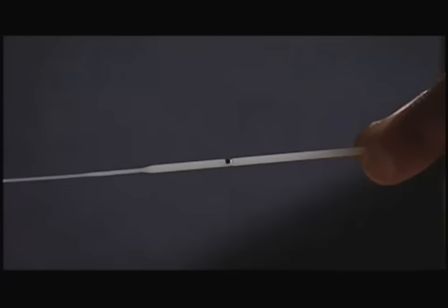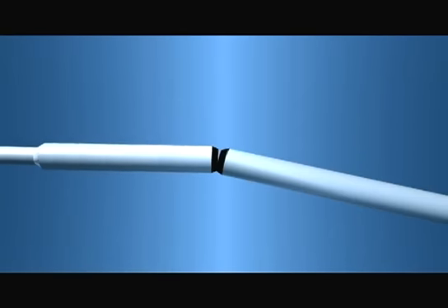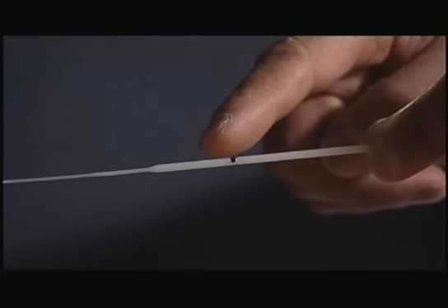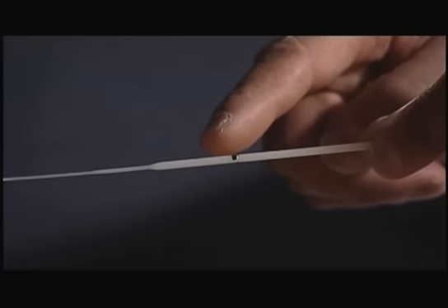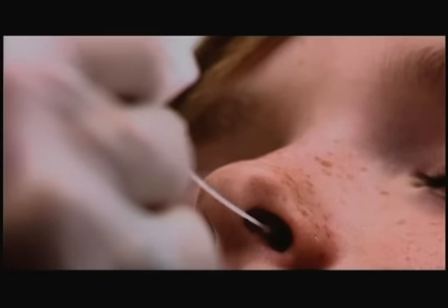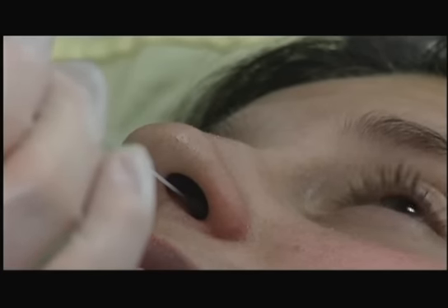On the thick part of the swab is a score line or groove shown here, which facilitates break-off of the swab into the collection tube once the sample has been taken. Unless you are unduly vigorous during the swabbing process, the swab will not break off at this point. You will also find that for some patients, where the swab tapers into the finest part, this is the depth to which it can be inserted into the nose.